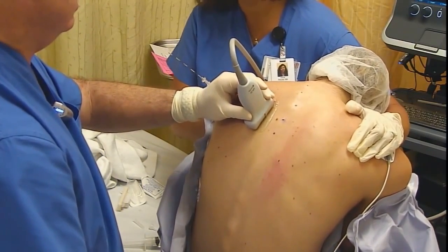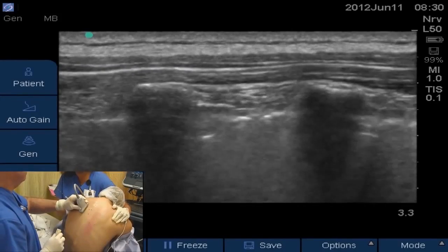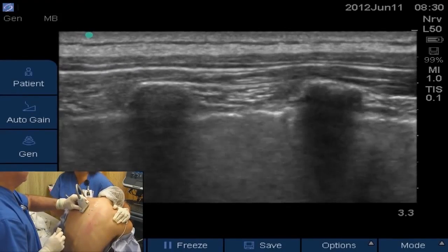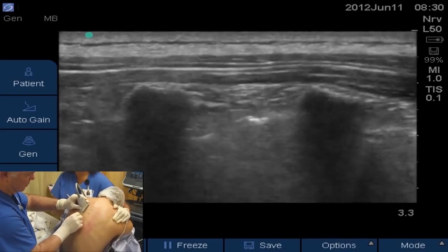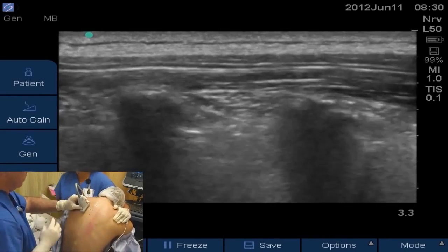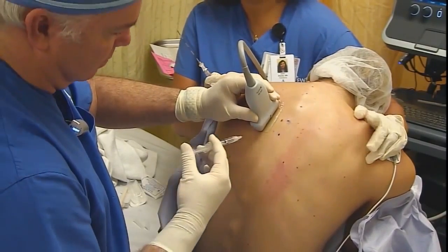We're lateral to the midline and here's our image on ultrasound. You can see the T3 transverse process, the T4 transverse process, the pleura — the shiny pleura you can see very easily — and then the costal transverse ligament just above the pleura. We have to get the tip of our needle in between the costal transverse ligament and the pleura to deposit our local anesthetic and make this a successful block.